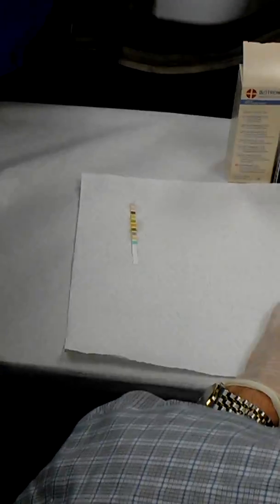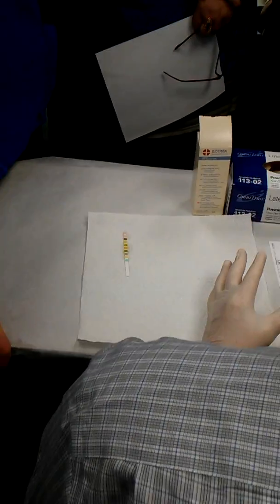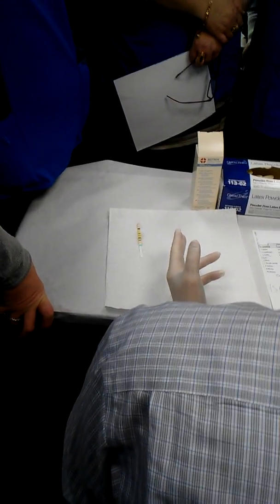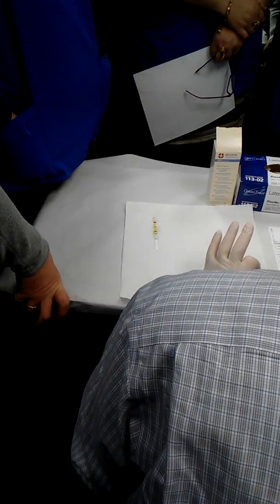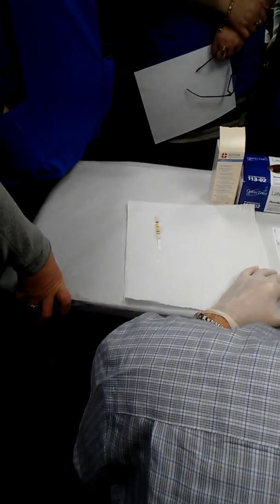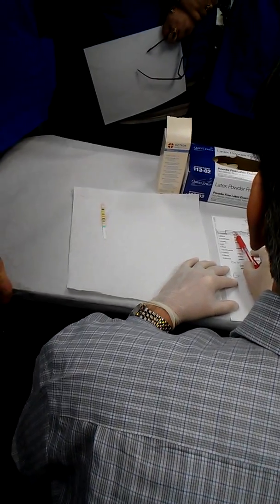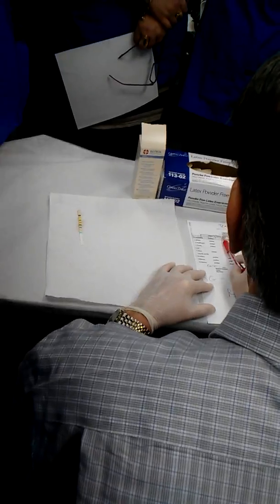Meanwhile, you understand what you are checking, right? So everybody is checking for your friends today. I gave everybody cups. You go into the bathroom, you bring in the urine, and your friend will check it for you. Don't be distracted. At the upper portion, you write patient, age, date of birth, date and time.